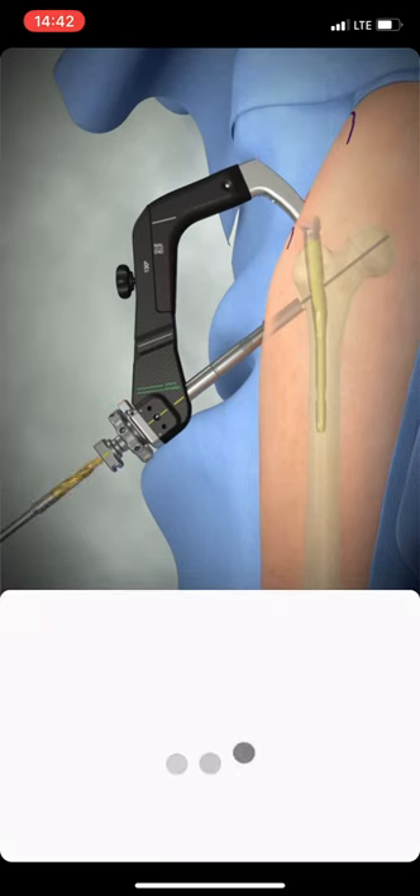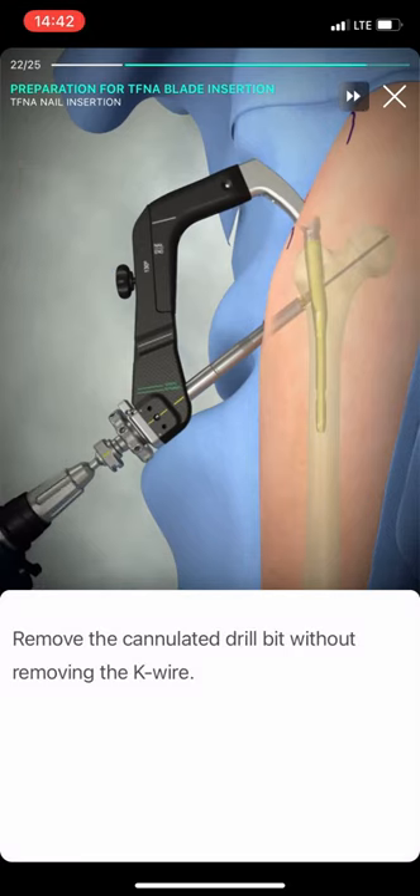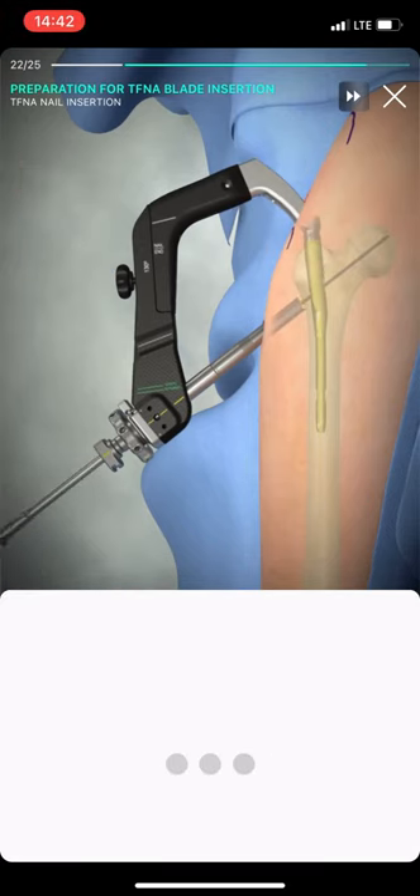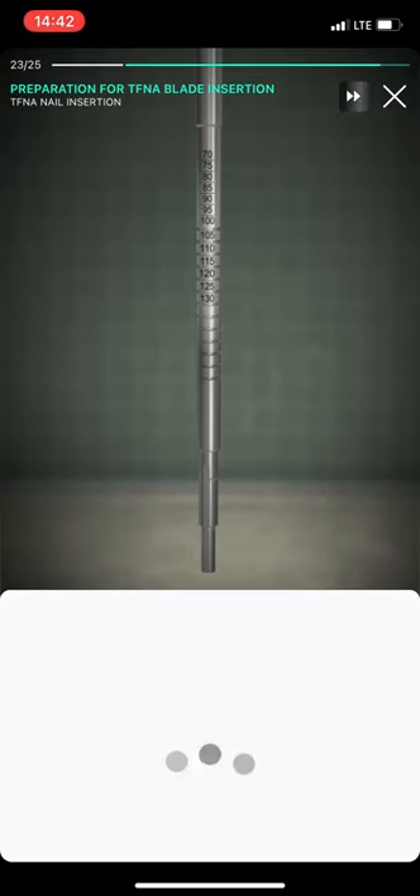Push the 16 mm cannulated drill bit over the guide wire to open the lateral cortex. The lateral cortex always has to be opened separately, using the 16 mm cannulated drill bit before using the reamer.